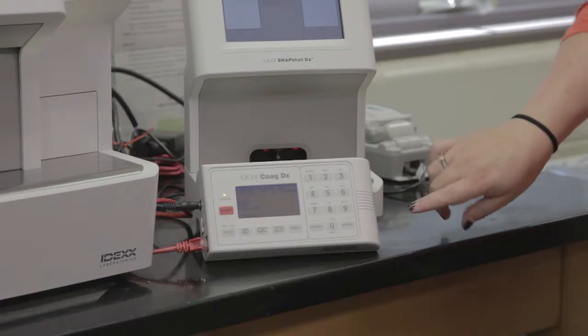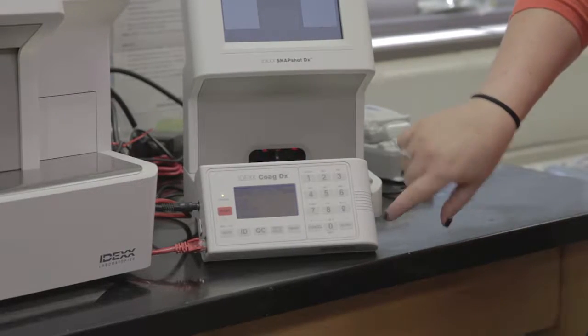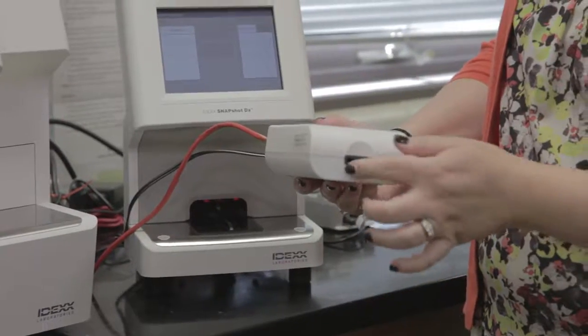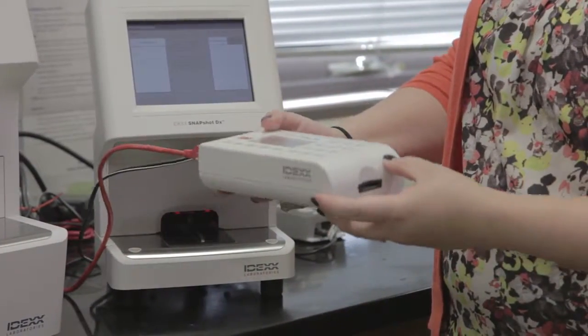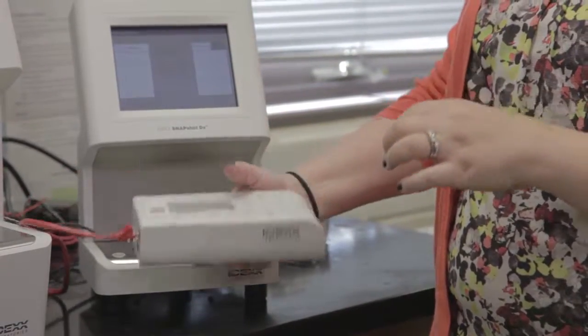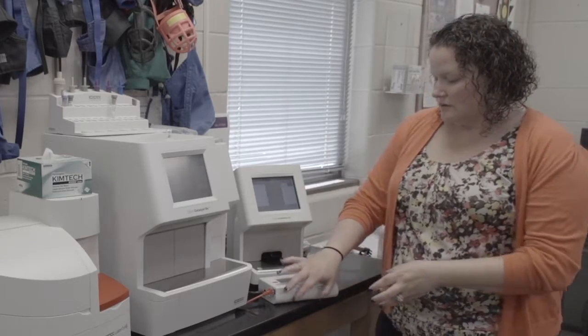Once your tubes are warm, you're going to insert them into the little port on the side, if you guys can see that. And you want the well sticking out. You're going to insert the tube into the port, and then you're going to put 3 drops of blood into the well. And then you're going to hit your start button. And it's very specific about the amount of blood you put in it. Too much and it's going to fail, too little and it's going to fail as well.